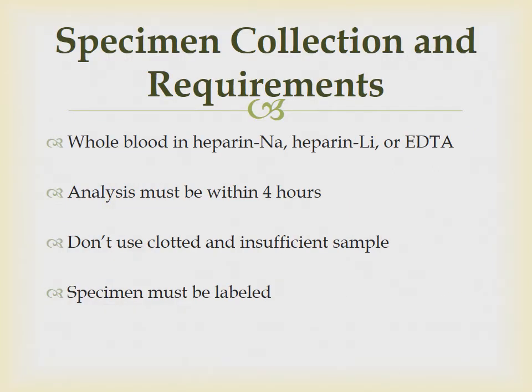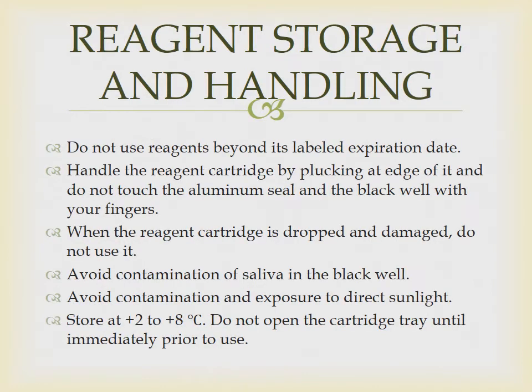Specimen collection and requirements: whole blood in heparin or EDTA. Analysis must be within 4 hours. Don't use clotted and insufficient samples. Specimen must be labeled. Reagent storage and handling: do not use reagents beyond the labeled expiration date. Handle the reagent cartridge by holding the edge of it and do not touch the aluminum seal and the black well with your fingers. When the reagent cartridge is dropped and damaged, do not use it.